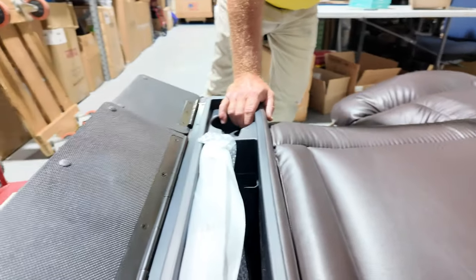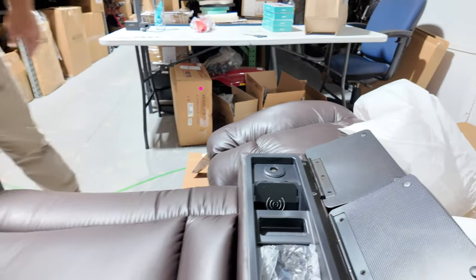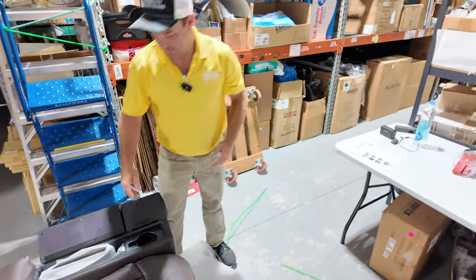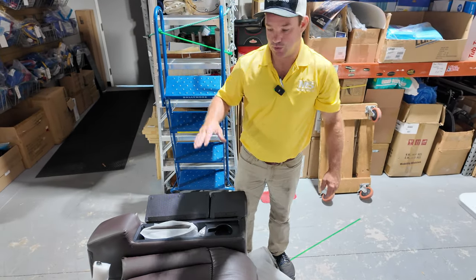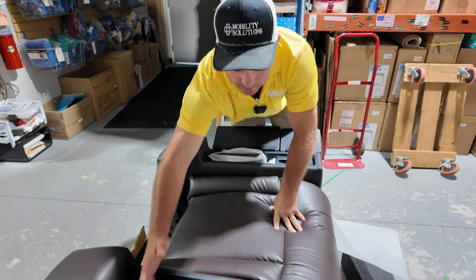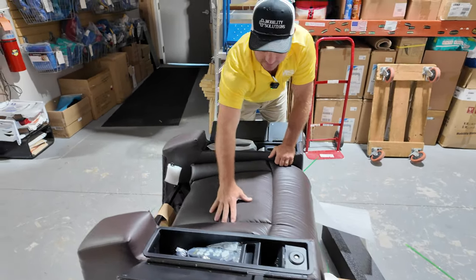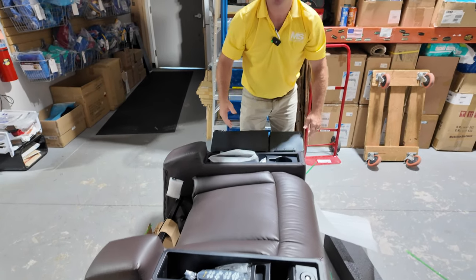Let me show you all these storage compartments. If you're in this chair all day, you have access to multiple compartments, a cup holder, and a wireless charging port. You can put the hand control back in and close these up if you're sleeping in it. This is their best seat in the Cloud series — very, very comfortable.